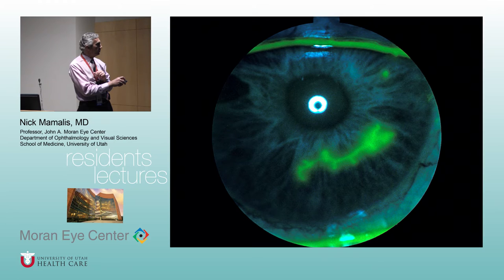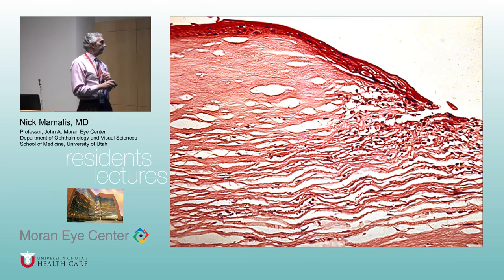And so if you were going to try to do a culture, you don't want to scrape right in the middle here because the epithelium's not in there. There's no active viruses there. You want to scrape at the edges here where the active virus is. And so the fluorescein dye is taken up where the epithelium's been denuded or broken up. So you can see that, and then you see there is a chronic kind of mononuclear inflammatory reaction, mostly lymphocytes.